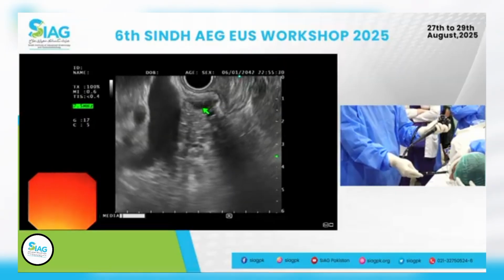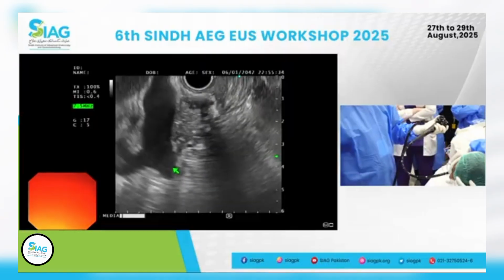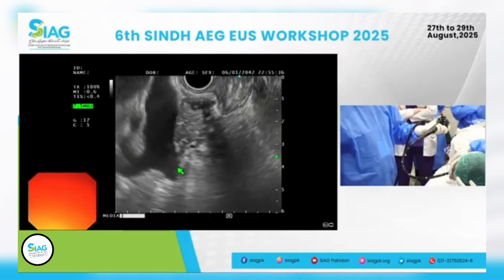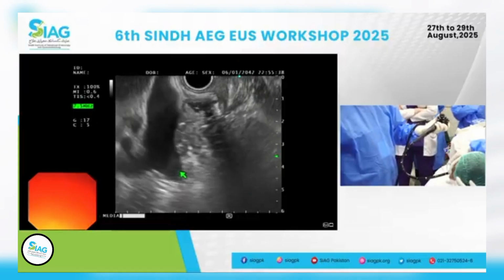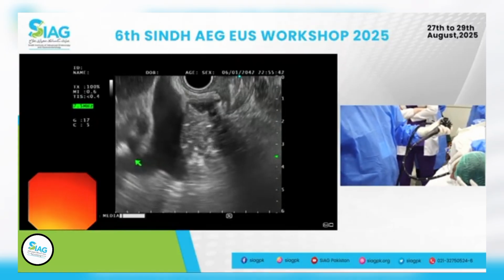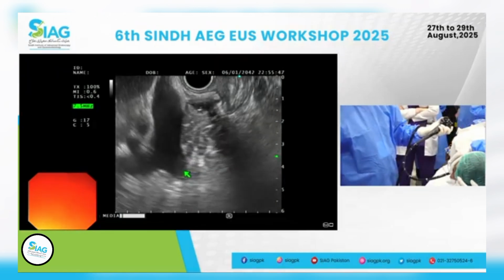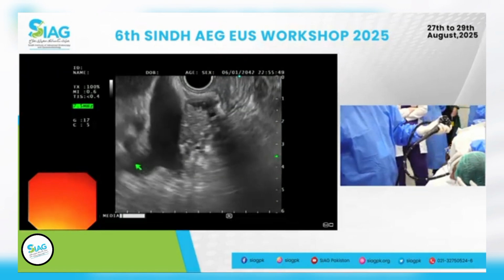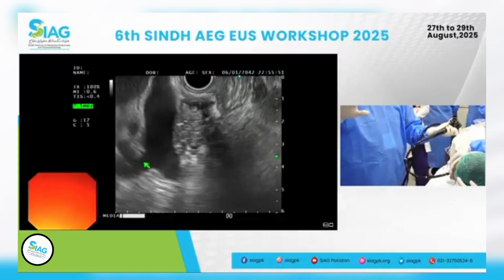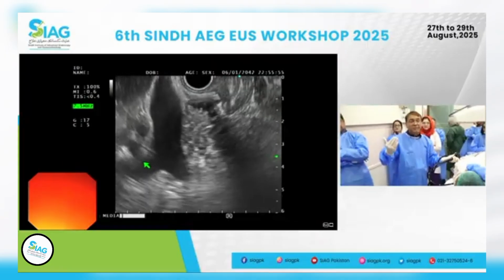You see the portal vein is right there as well. Portal vein, you see that here. Who is going to tell me which branch is this? Is this splenic or SMV? And this one? This is first SMV. This one is the... That's SMV. And this is splenic. Yes. What happened? Switched. So what we mentioned about that earlier.